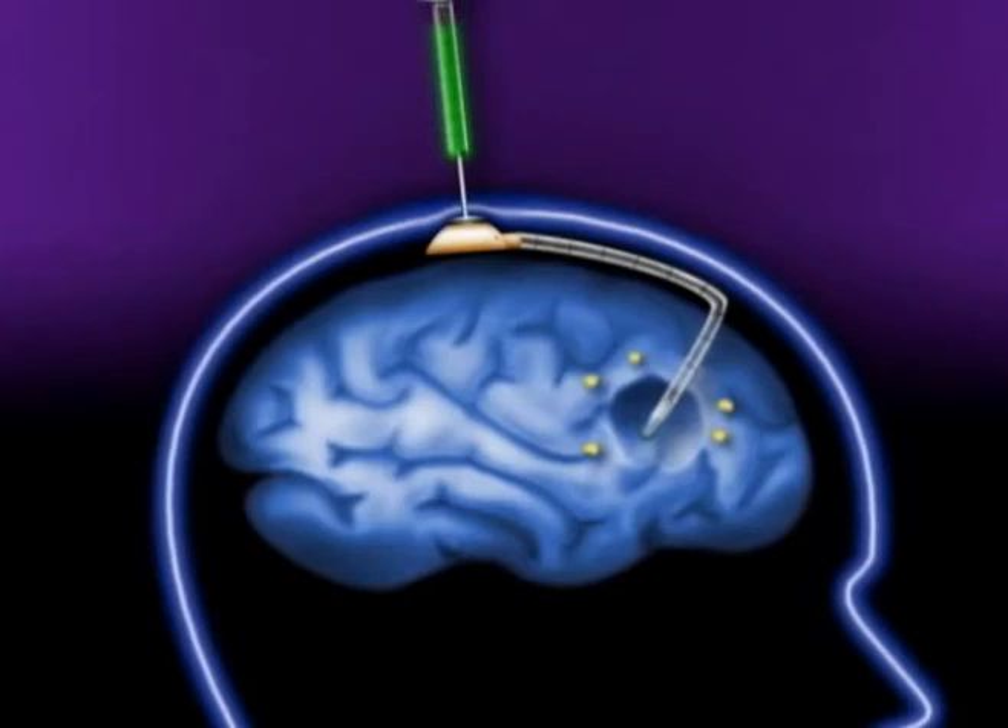Once the patient has recovered from surgery, a solution containing Iotrex, a proprietary liquid radiation source, is injected into the catheter and fills the balloon.